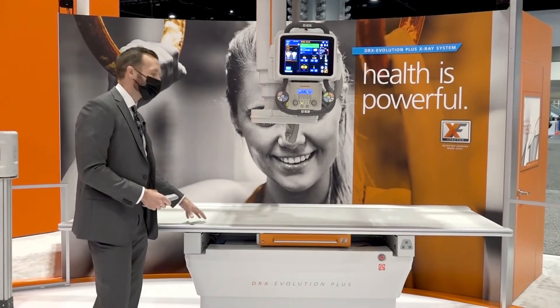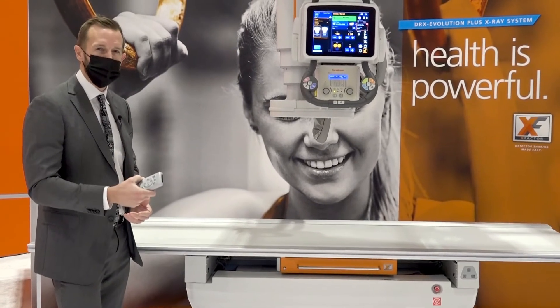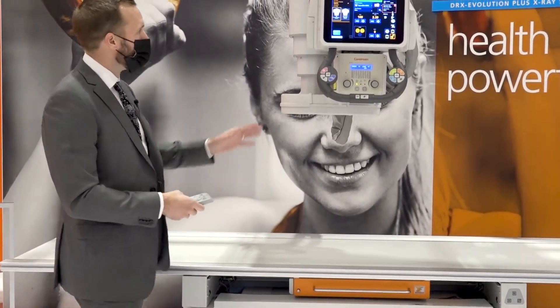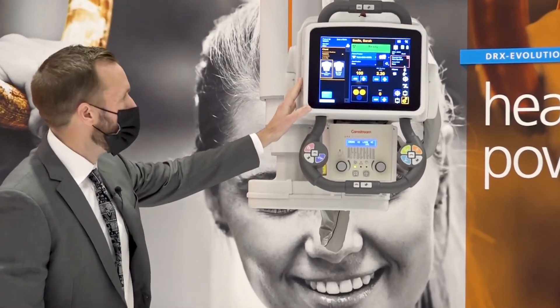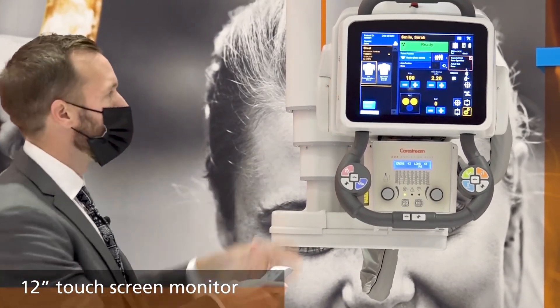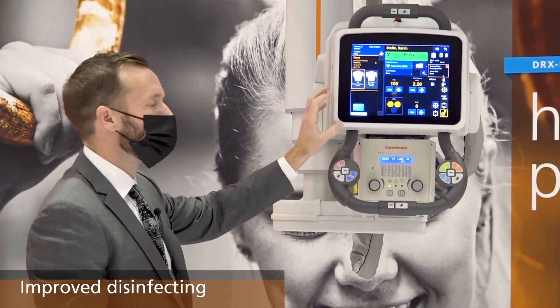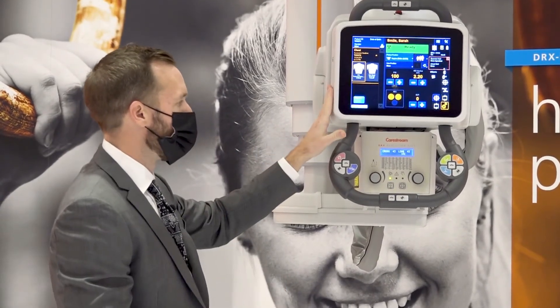The tabletop surface has also been updated to a new material, which is designed to be more puncture resistant and to withstand the clinical environment. We've made adjustments to our tube head touch screen. The monitor has been increased — it's now a 12-inch monitor, and it is flush mounted. What that allows for is easier cleaning and disinfection, with less risk of liquid collecting at the bottom of that monitor and causing any potential problems.